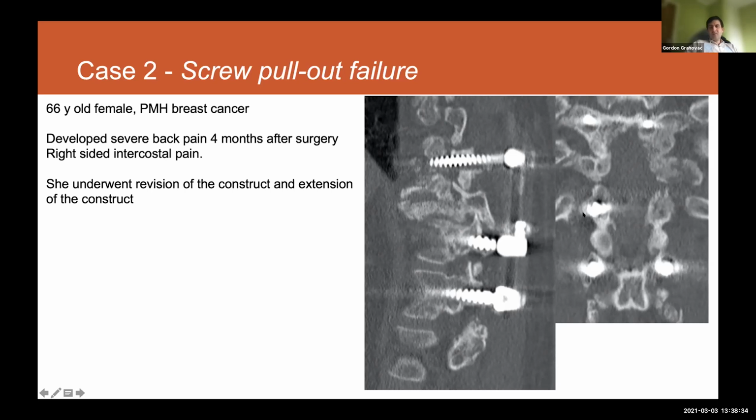It is noted that this patient had the I factor implanted on the initial surgery, and you will see that there is a bony formation in the lateral gutters. That's the first time when I started using the I factor. One of the first cases when I saw, doing the revision, that inside I don't see the scarring tissue filled with the ceramics. I actually have been visualizing the bone.